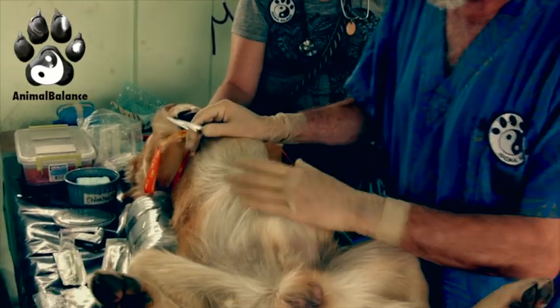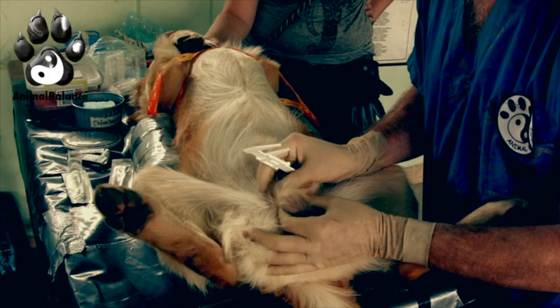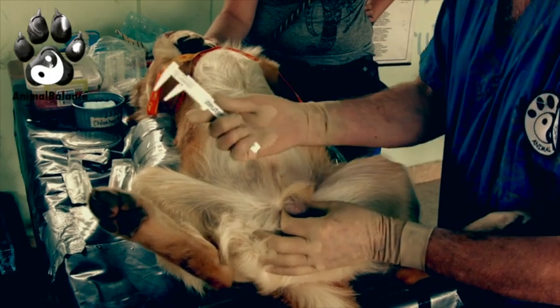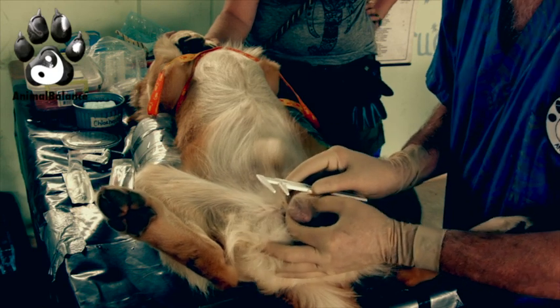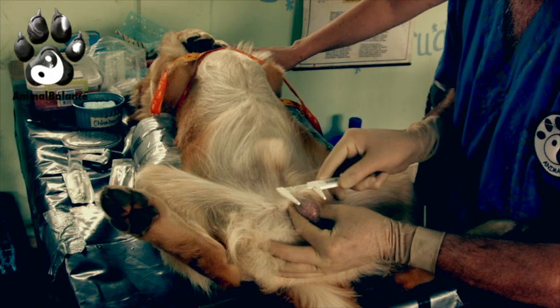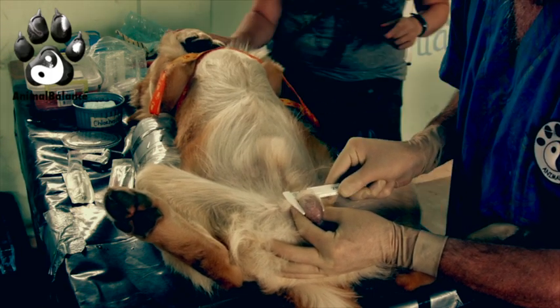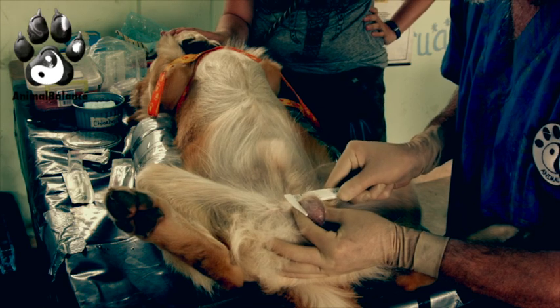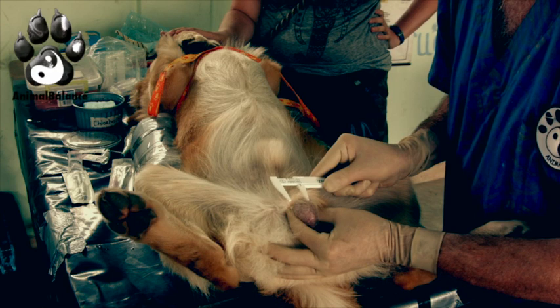We've given him a little bit of sedation so he can lay in dorsal recumbency, allowing us to go through the whole procedure. The first thing we're going to do is measure his testicles using a special caliper that calculates the dose based on the width — not the length — of the testicles. We get a very accurate measurement, and the dose for the right testicle is 0.8cc for a 24-millimeter testicle.